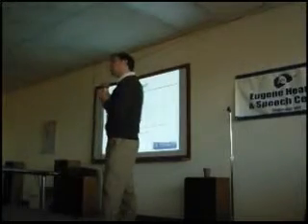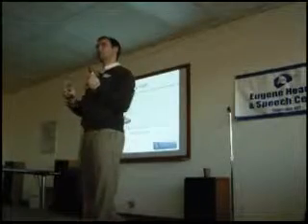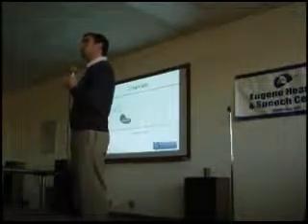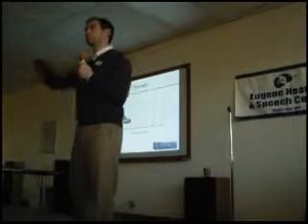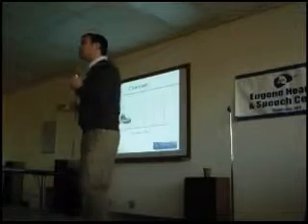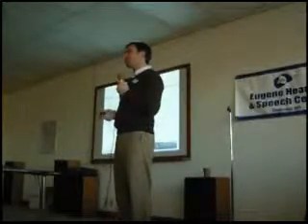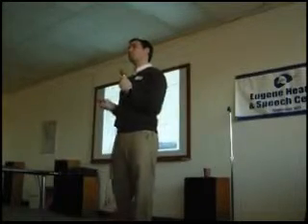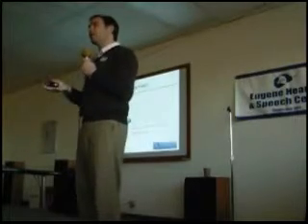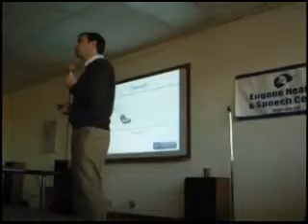If 2 sounds come into this one channel with one set of directions, it can only handle one of them, or it will only handle one of them. It'll handle the louder one, because the louder one is typically the one that's going to be more noticeable to you. So in this case, this hearing aid is going to address sound number 1 much more so than sound number 2. It's already going to work. It's going to amplify or reduce the sounds properly, but maybe not as good as it could work if you had more channels.